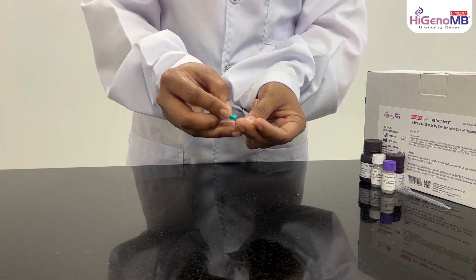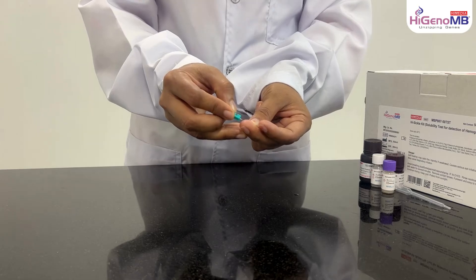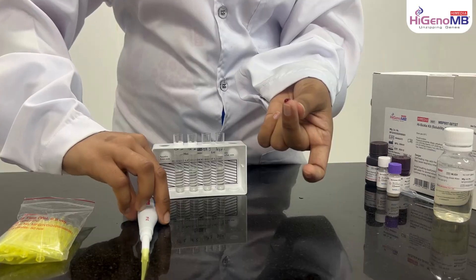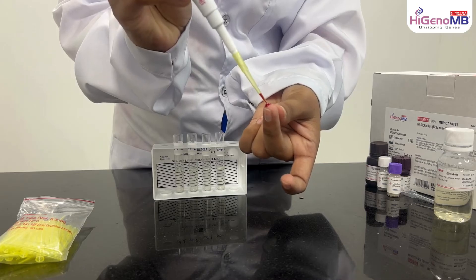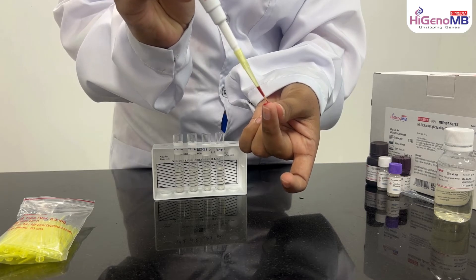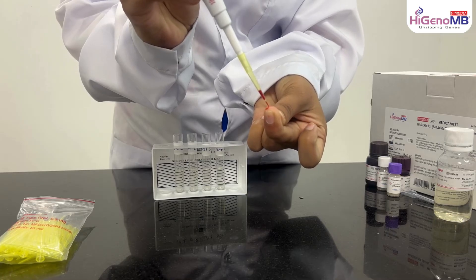For blood pricking, put a lancet, take out the blood, and add the blood sample by use of the pipette to the test tube.